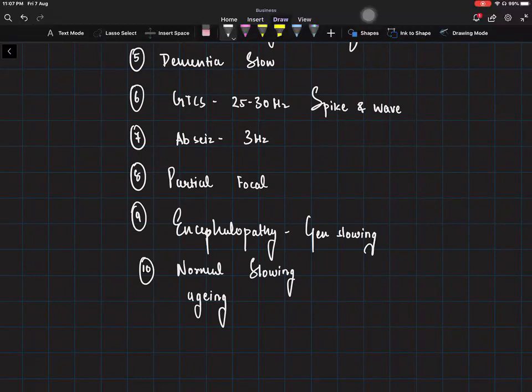Sir, this is Varsha. I have a doubt, sir. How do we differentiate between encephalopathy and delirium EEG, sir? Yeah. So these are just the EEGs that you have so far. But in real life, you don't just make a decision based on the EEG.